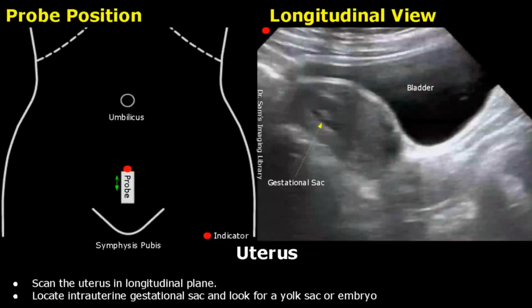Hello everyone, this is Dr. Sam and this video is about obstetric ultrasound probe positioning. We will talk about probe placements for a pregnant uterus. The only focus here is to scan the pregnant uterus and the embryo and fetus. We will start from early pregnancy.